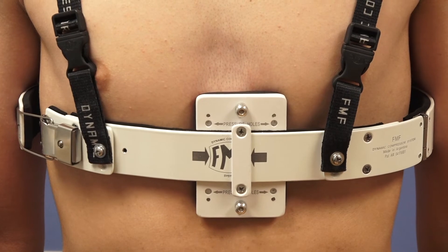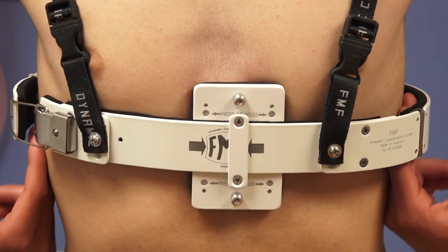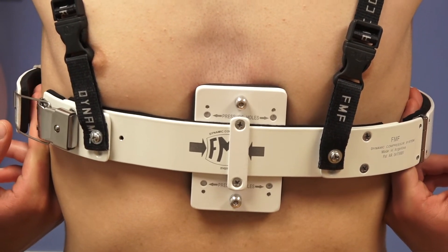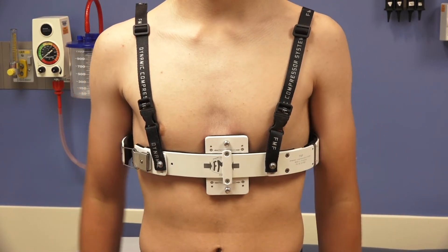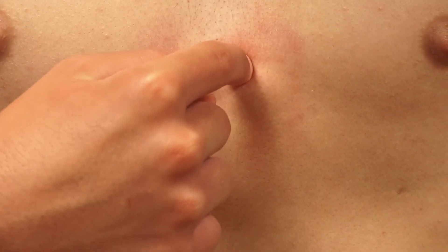When the visit starts, we will first want to check the brace fit. You should be able to take a deep breath in without restriction and be able to place at least one finger at each side. Next, we will check how loose the brace is by having you show us how easily the brace moves up and down. We will also want to check your skin to make sure there are not any areas of skin breakdown or irritation.